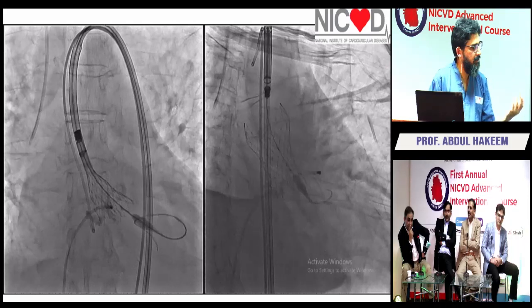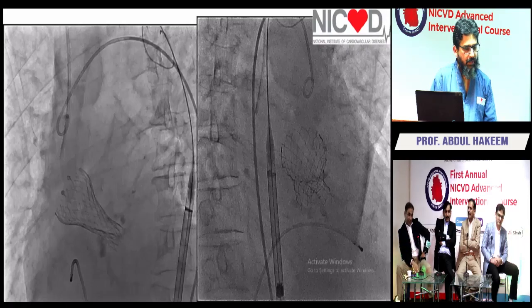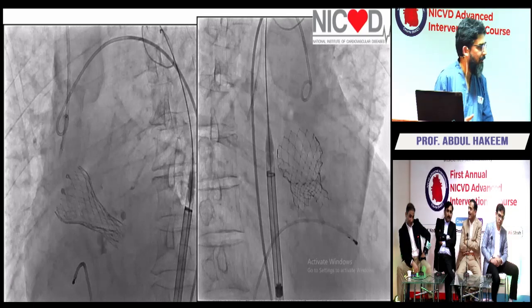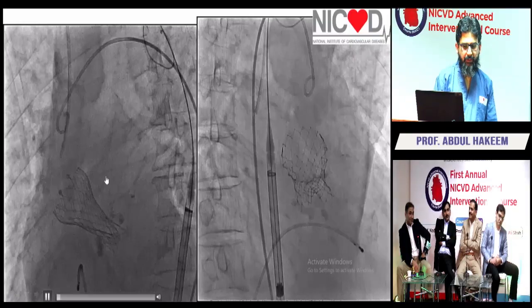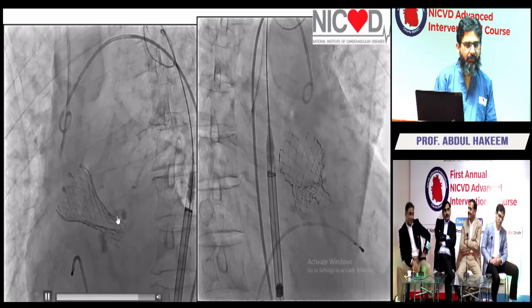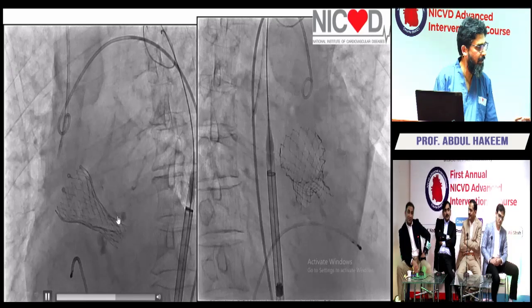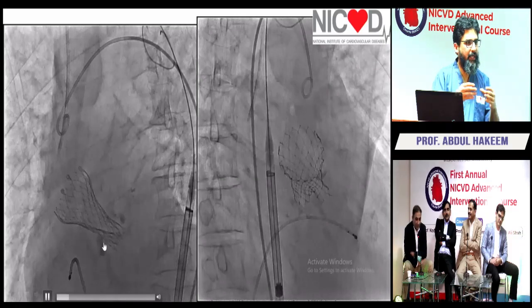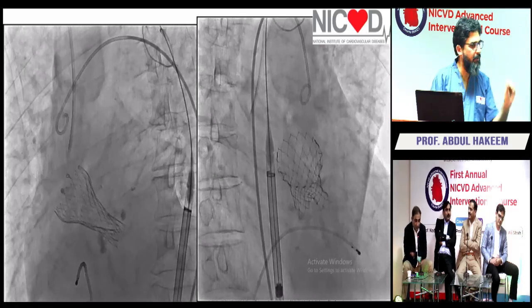So this is the cusp overlap. But then when you move to the LAO, you're like, what the hell just happened? So any comments on this? Just pay attention to the calcium here, right? We are done with the pre-balloon. You guys saw that very nicely. In the previous one, it looks very nicely expanded, but here it's completely constricted.